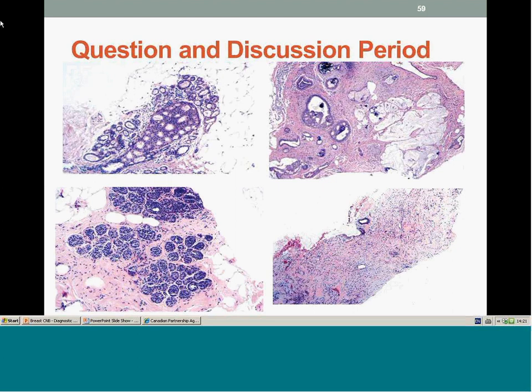Question. We have had a few cases of ER negative, PR positive with an outside lab. With those cases, is there a role for tamoxifen in ER negative, PR positive? They exist. I get a few of them. My understanding from the literature is that they're approximately 4% or less. Some people say that ER negative, PR positive represents dysfunctionality at the molecular level. I don't know the details of that, but we do see them. And usually the PR in those cases is a weak PR. It's not strong PR. If you get strong PR, then you've got a technical problem, because a strong PR should not be associated with an absent ER.